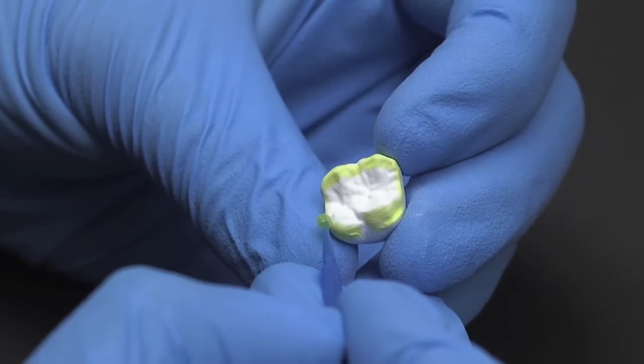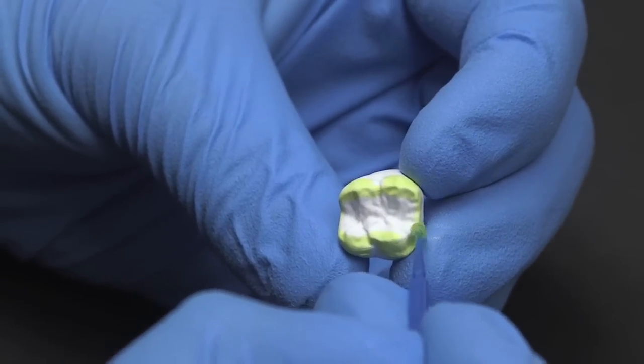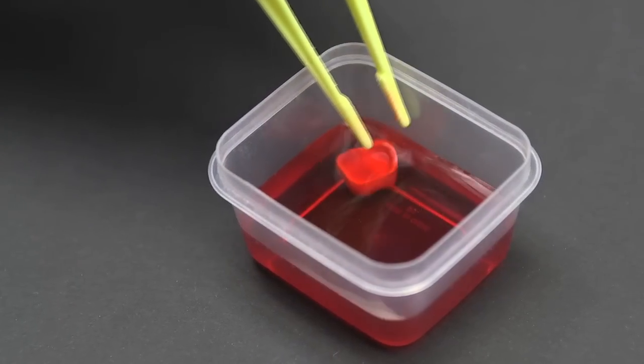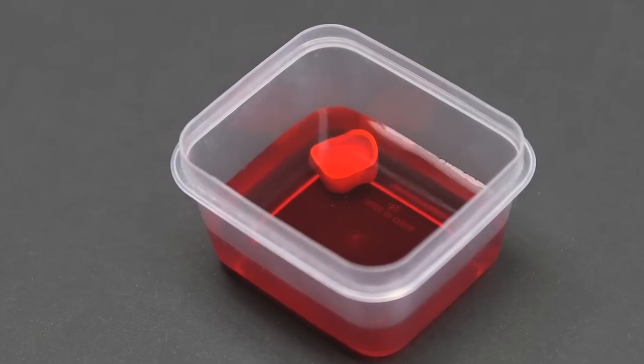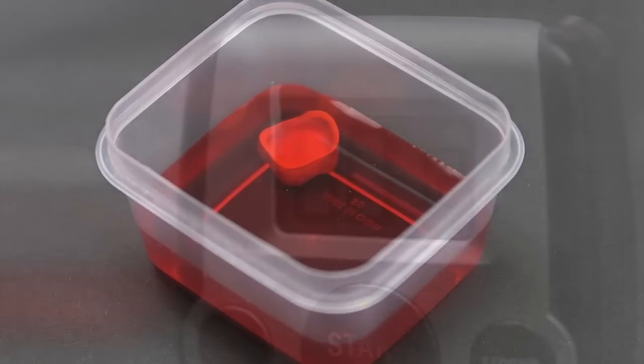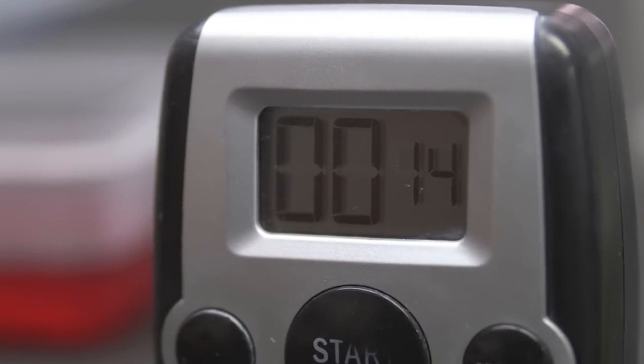Once you have painted the restoration, it is time to dip the crown in the shading liquid. Be sure to use tweezers to prevent the liquid from splashing. When the crown is completely submerged in the shading liquid, we recommend it remain undisturbed for 15 seconds.